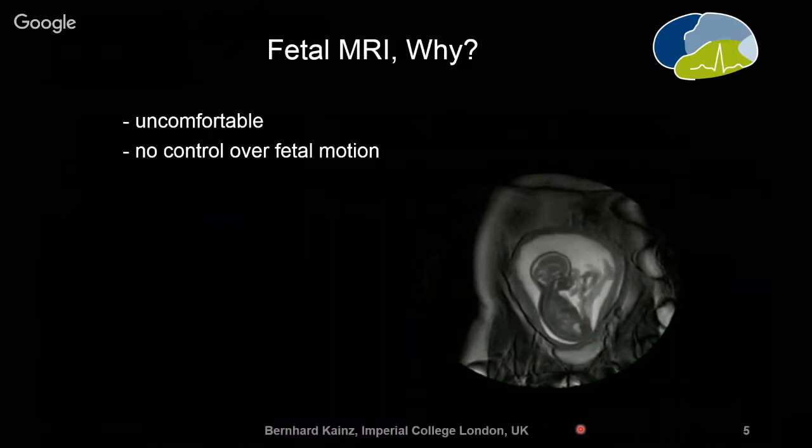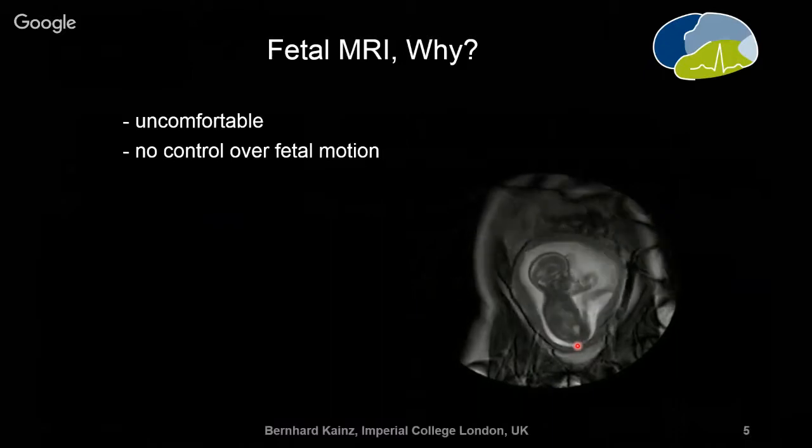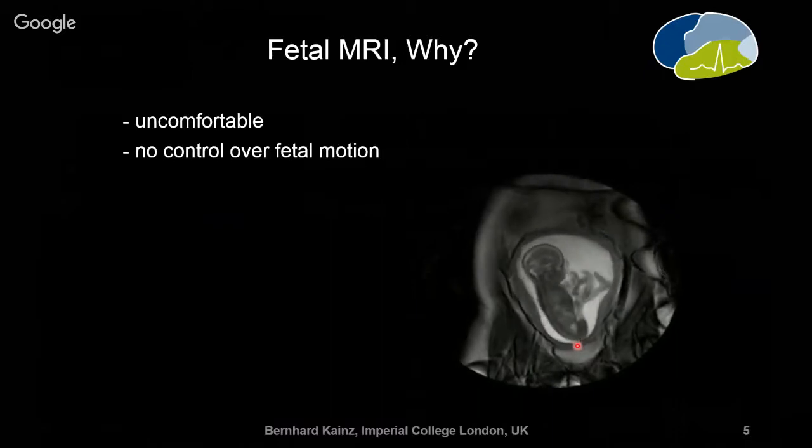The fetus will not care and continues doing this kind of party like this one. In the ideal case, they are sleeping and then it's fine. But this is already a medium bad case where the fetus moves around a lot.